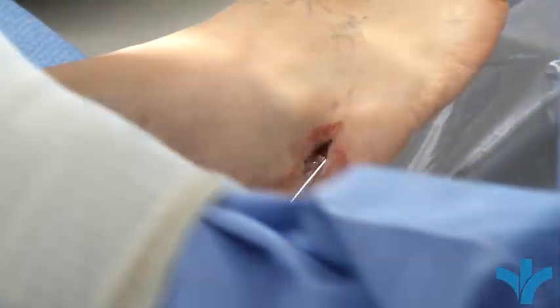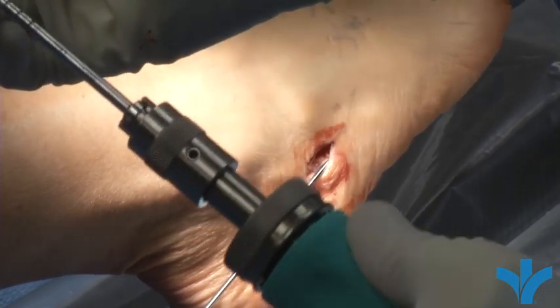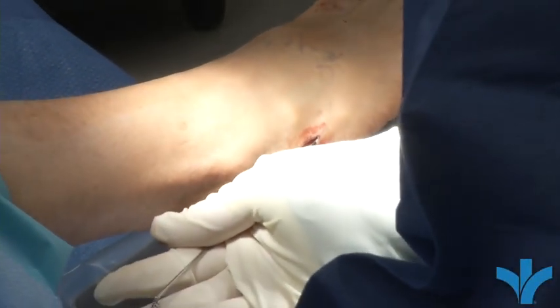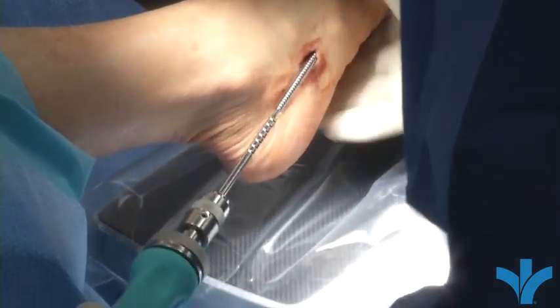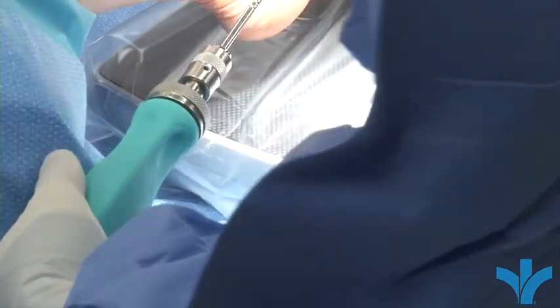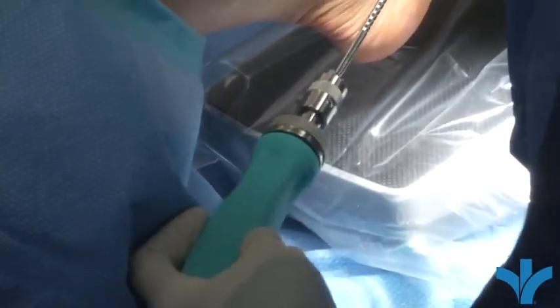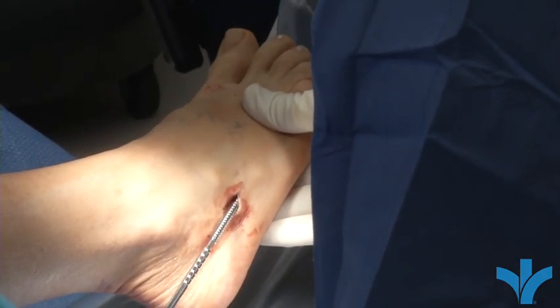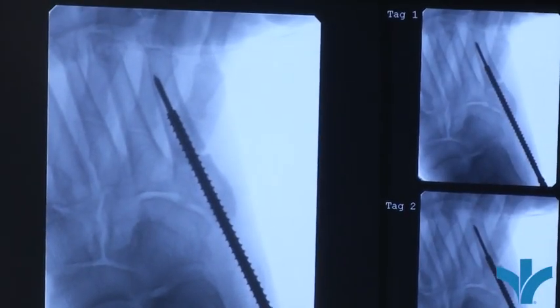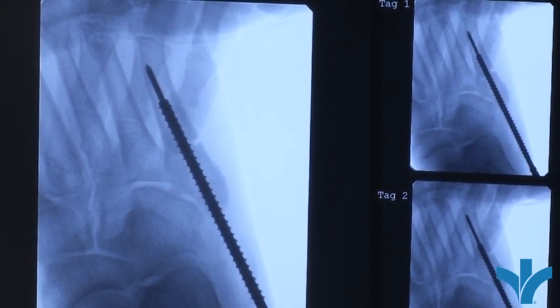This device is a tap. What the tap does is make a pathway for the screw to go through inside the middle of the bone, allowing the threads to actually bite. We use the tap to make room for the screw threads to have what we call purchase or bite, so we get compression — squeezing of the fracture site together. Everything we do is under x-ray because we don't want to go out of the bone anywhere and cause a problem. You can see the threads fitting inside the canal of the bone, with the fracture site visible as a gap on the outside of the bone.